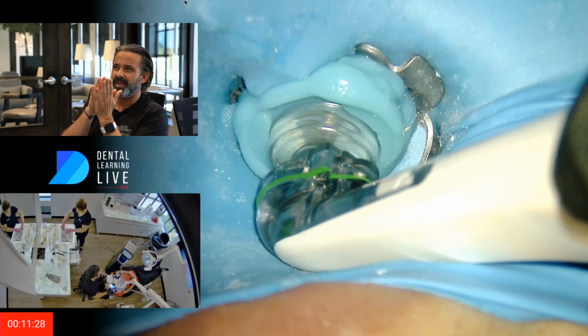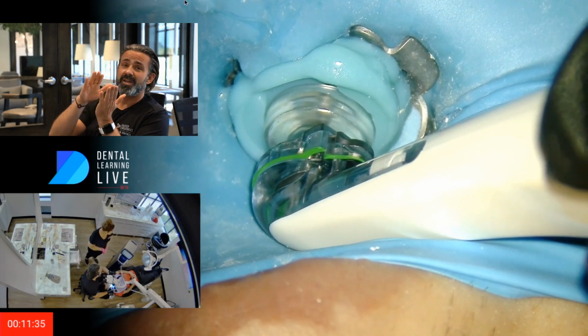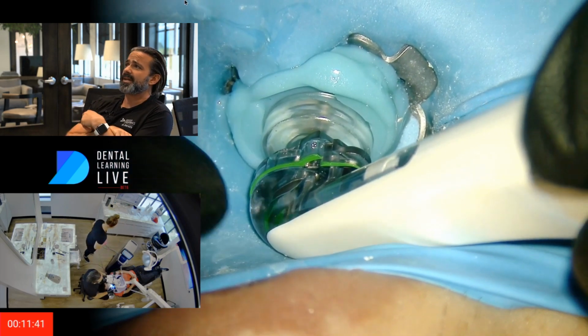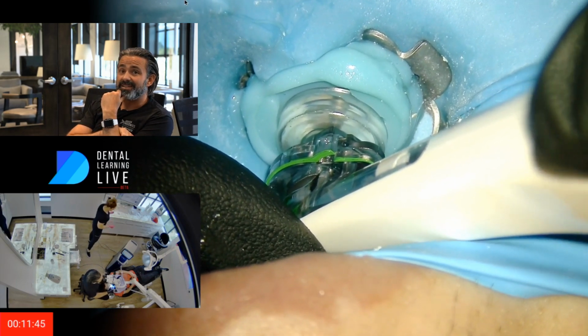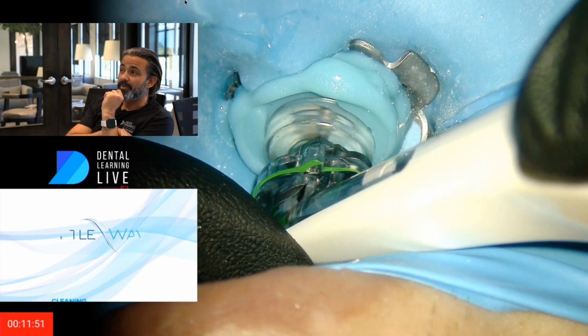I felt like it was probably just the undulations in the pulpal floor. I could feel like a bump somewhere. So then I just go one size smaller, which is the green. That was the cap I selected, put the cap on, and then lo and behold, I'm just connecting it to this platform.